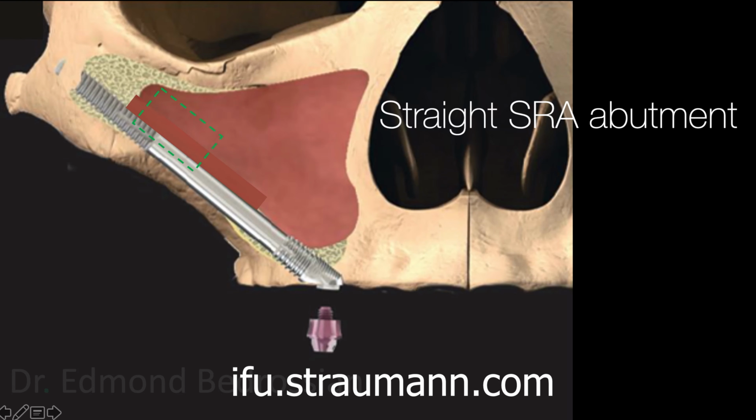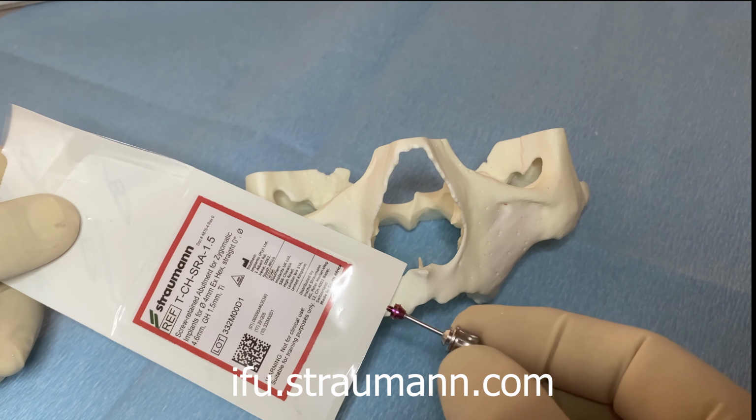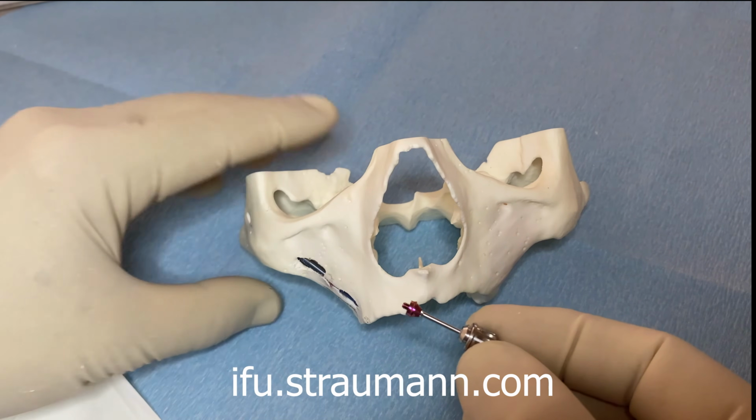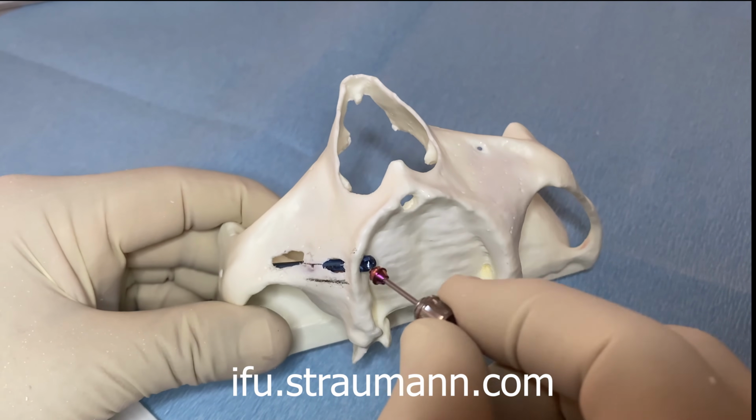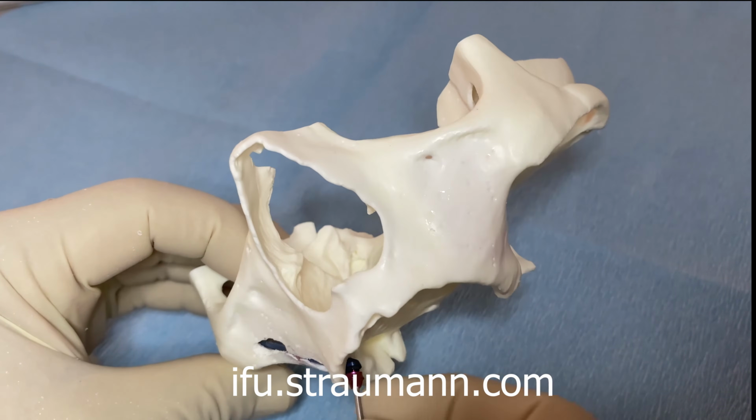If immediate loading is considered, the SRA abutment is placed and torqued to 35 Newton centimeters, followed by connection of the temporary titanium cylinder and conversion of the patient's prosthesis either directly or indirectly into a fixed provisional hybrid prosthesis. So the SRA abutment is a straight abutment for the zygoma implant, and we can go ahead and place it on as you would any other SRA abutment.